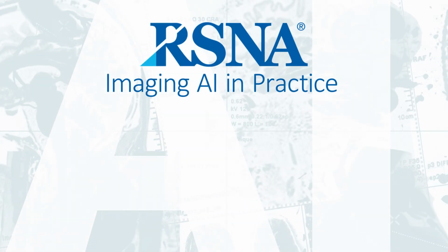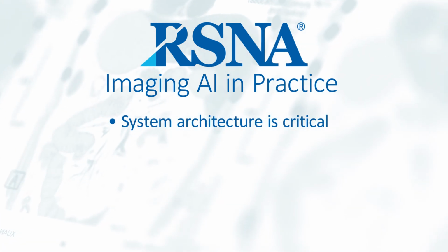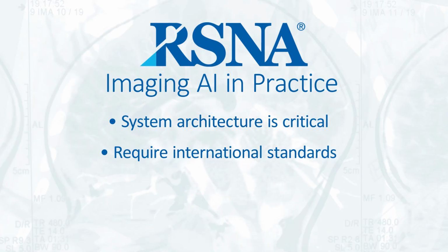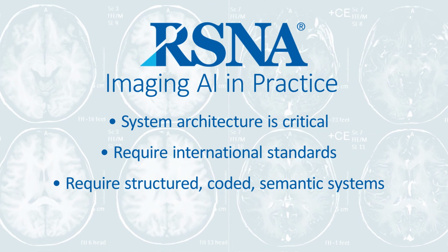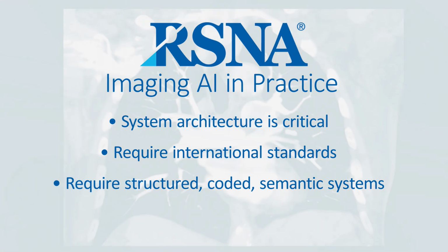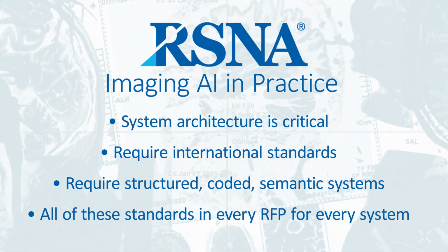We hope that you consider the following takeaways from this demonstration. The architecture of your overall system for the hospital is critical. Requiring international standards such as IHE, DICOM, and HL7 FHIR will enable interoperability. Requiring structured, coded semantic systems such as RadLex, LOINC, and SNOMED will make the AI and other data flow through your system seamlessly. And finally, you will need to ask for all of these standards in every RFP for every system.